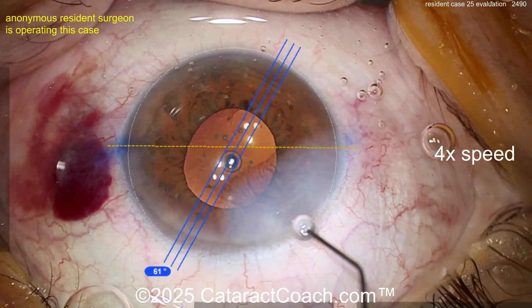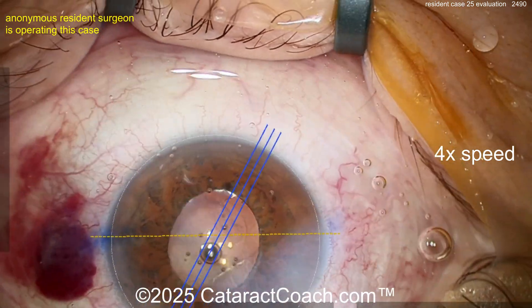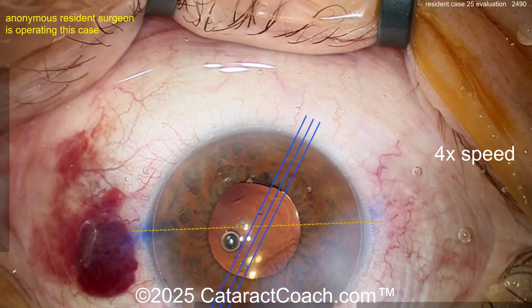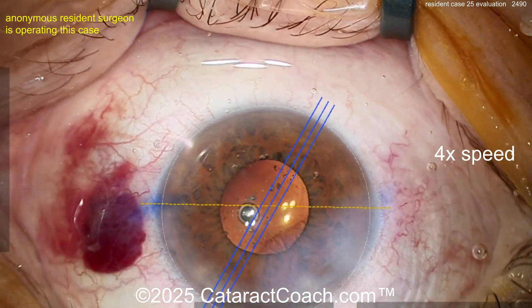Whoa, whoa, whoa — easy with the hydration! How much are you going to hydrate? Oh my goodness, stop with the hydration. Look at that — it's in the red reflex. Your hydration is in the red reflex. No, no, no — we've got to go work on some basics. You have amazing hands and you could be an amazing surgeon.